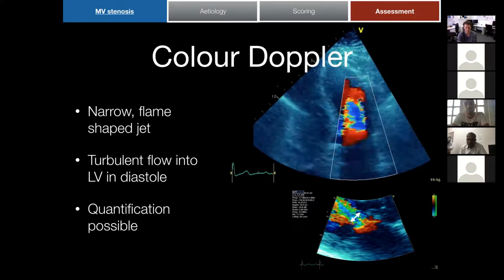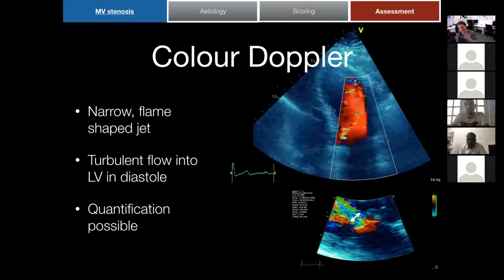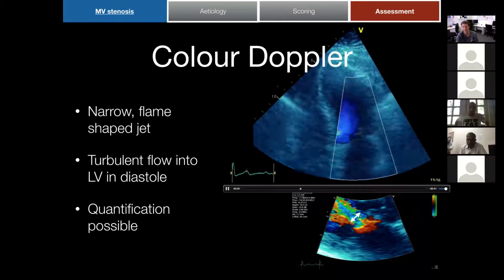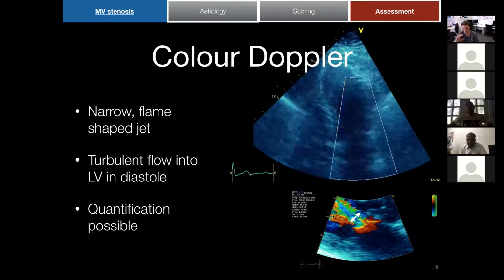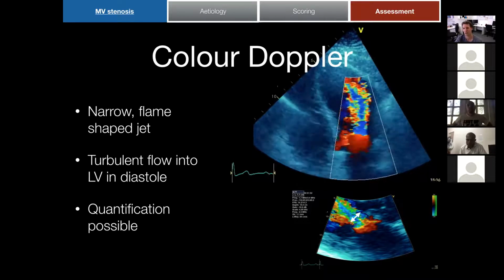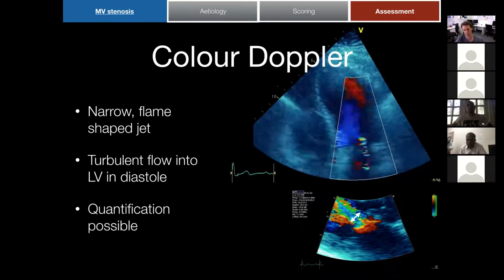And particularly if someone's in atrial fibrillation, the accuracy of that measurement can go down. Again, with that, you've got to make sure your focus position is in the right spot and you're zoomed in on where you want to look, so you get the best temporal and axial resolution. Particularly, obviously, that's important when you're trying to measure something that's only millimeters in size, of course. All right.